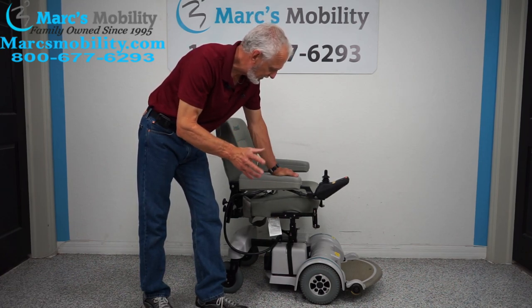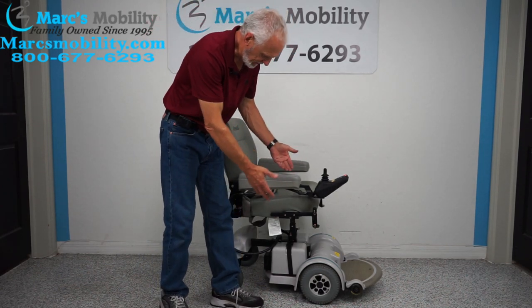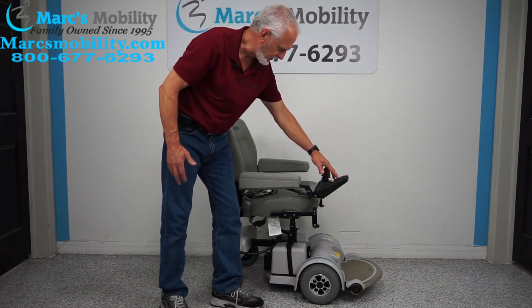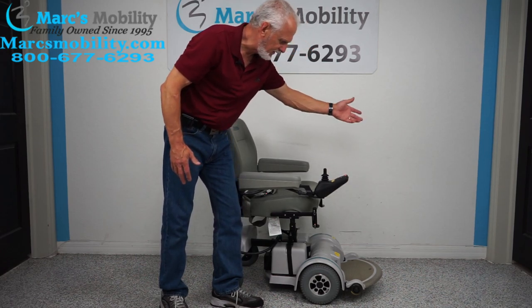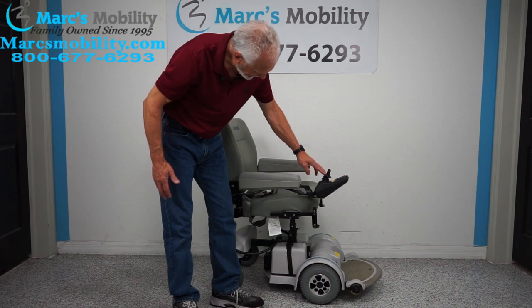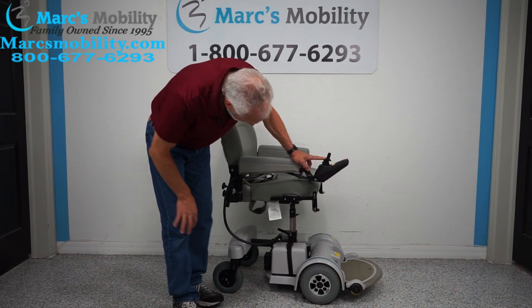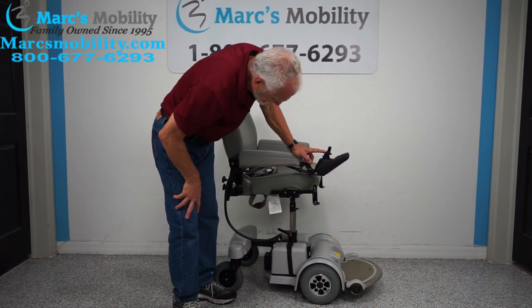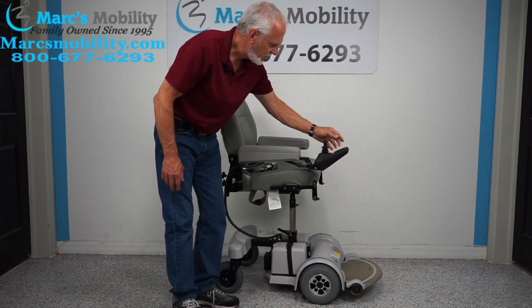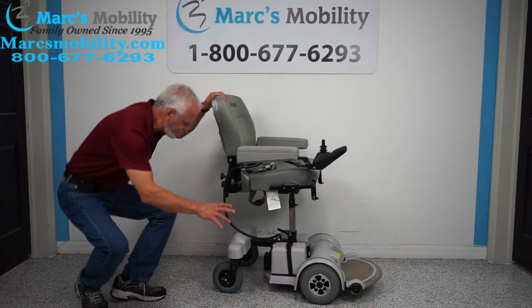A couple of things with this chair: it's a Hoveraround MPV-5 with a five-inch seat lift. If you want the seat to go up, you go to your screen and look at the two buttons with a picture of a seat, press down on those buttons, then use your joystick to make the seat go up. You can see the seat going up right now — that's your seat lift. This chair will not drive with the seat elevated.